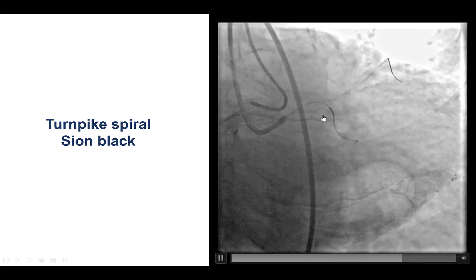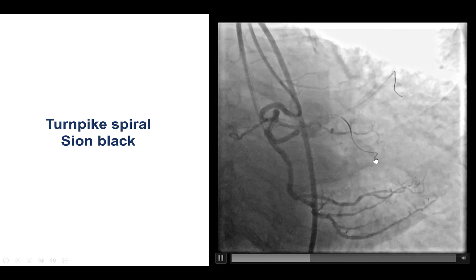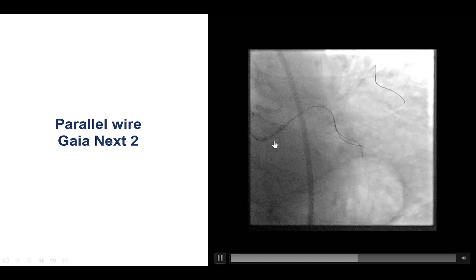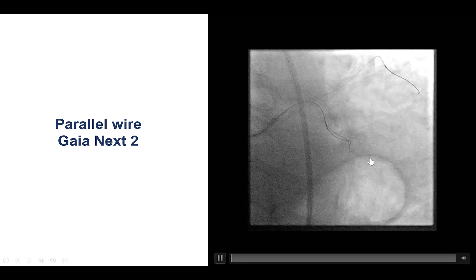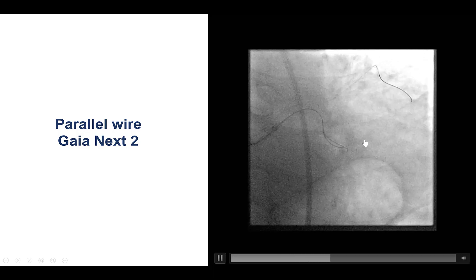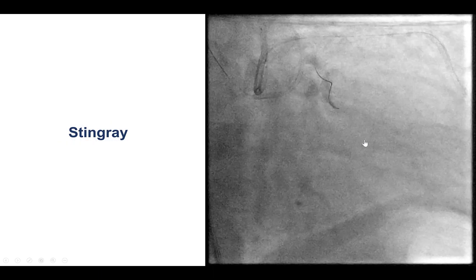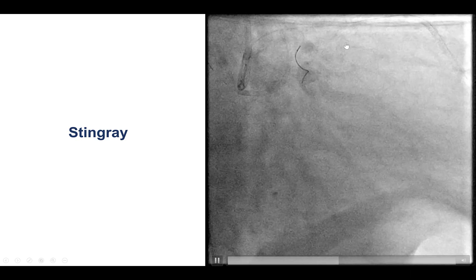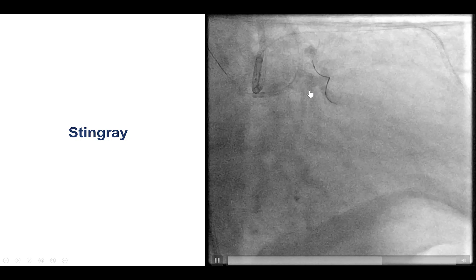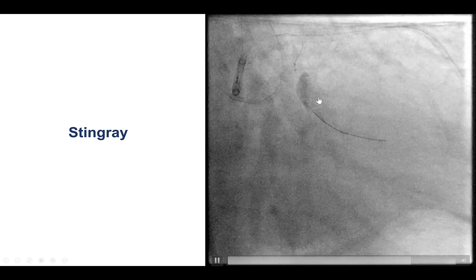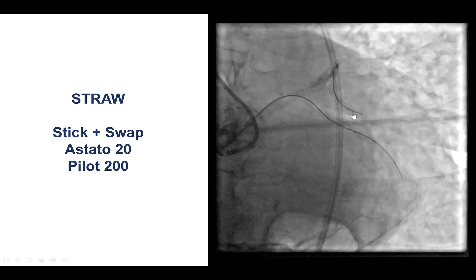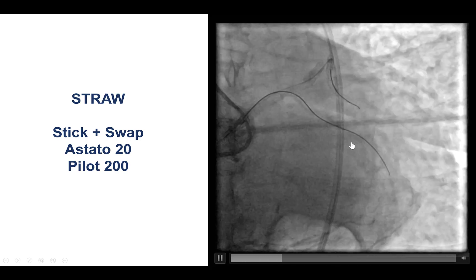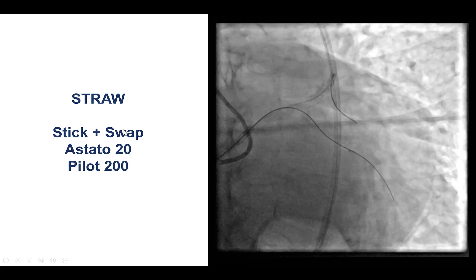A Turnpike Spiral catheter was used along with a Sion Black that went into the sub-intimal space. We tried parallel wiring using a Gaia Next guidewire, but despite attempts, we were unable to enter into the distal true lumen. We therefore decided to try re-entry, which involved delivering a Stingray balloon. Delivery of the Stingray was difficult; we had to advance the guidewire a little further distally. Then we were able to get the Stingray positioned, and after aspirating from the side port, we did the re-entry attempts using the stick-and-swap technique.